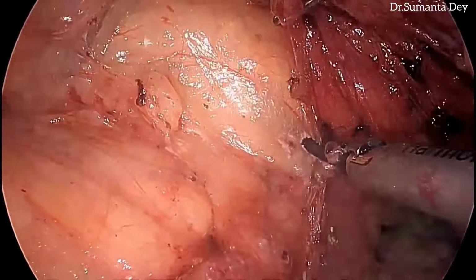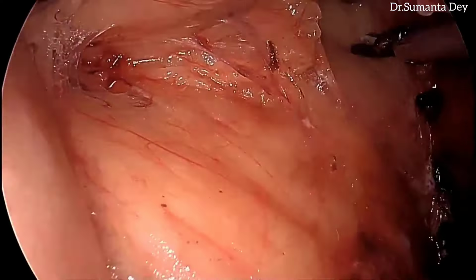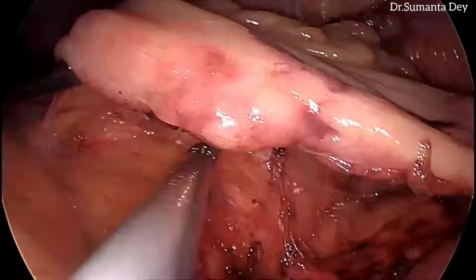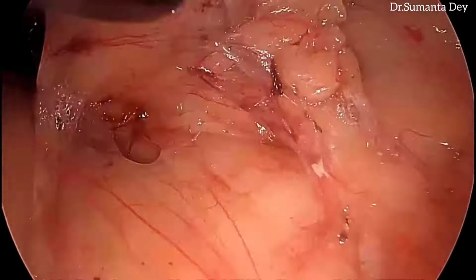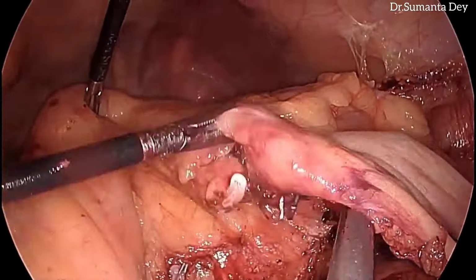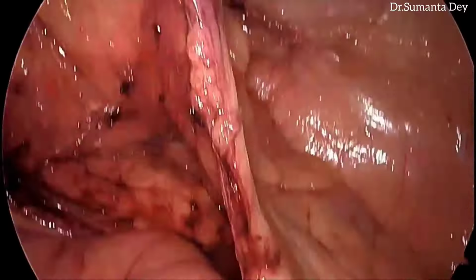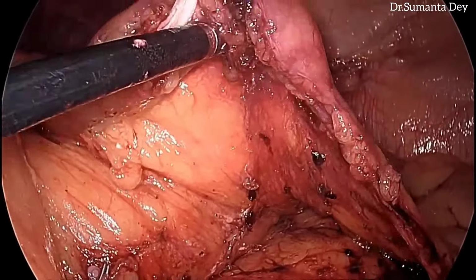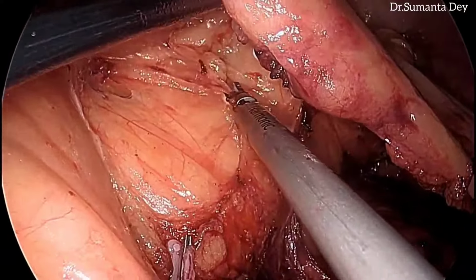So you can see there is a clear plane, a clear loose irregular tissue plane, and a good amount of traction with the left hand instrument is very important, so that you can identify the plane in between, and there is a completely bloodless plane. Sometimes there are perforator branches, but in this case there was no other vessel in that plane.